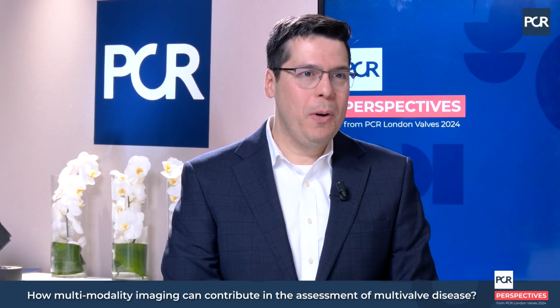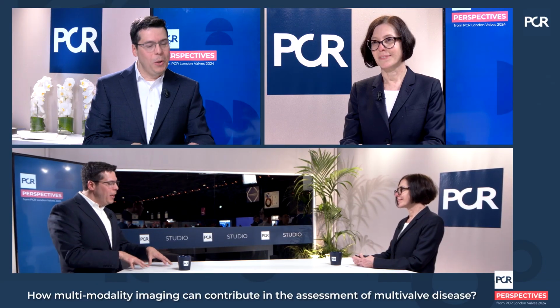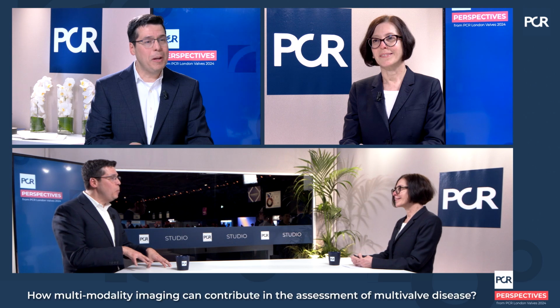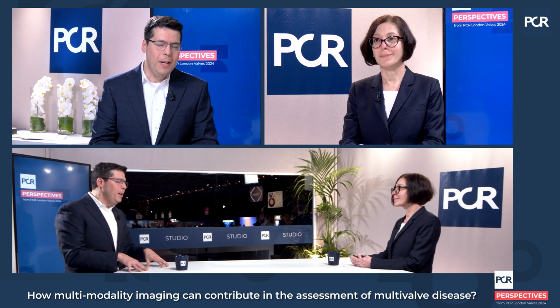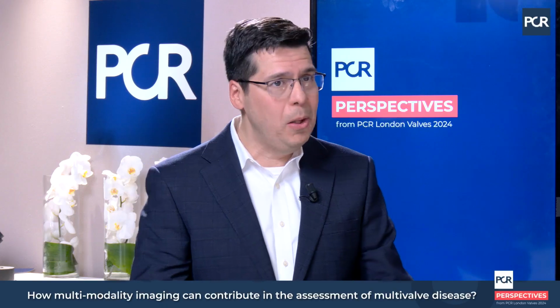Certainly, there are pitfalls and challenges that we have to recognize, right? The assessment that we use by Doppler has some challenges when we face a regurgitant valve disease and a stenotic disease. Let's take, for example, low flow, low gradient. It's important to recognize that that exists, but what is causing that low flow? When you have mitral regurgitation or tricuspid regurgitation, the gradients are going to be lower because there's not enough flow. Assessing the morphology of the aortic valve is important.